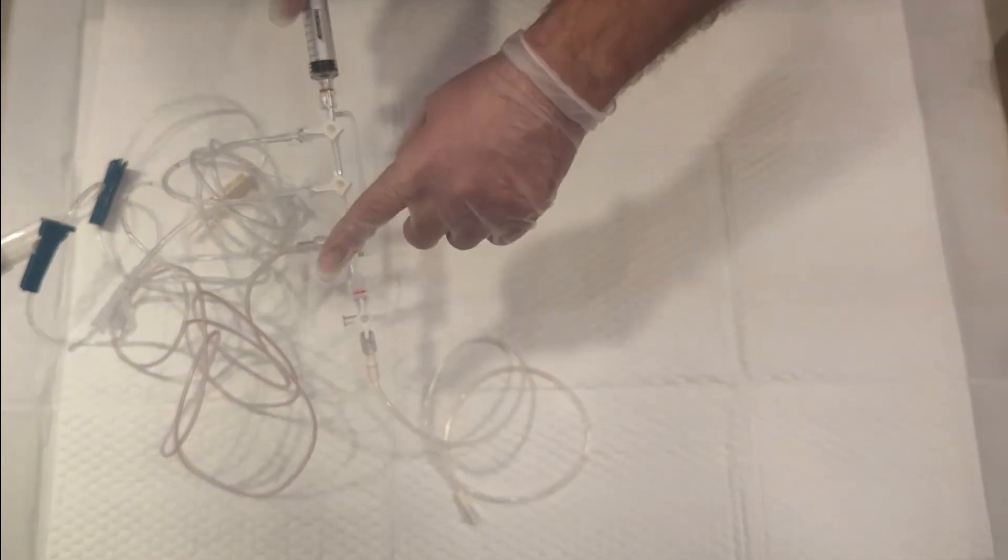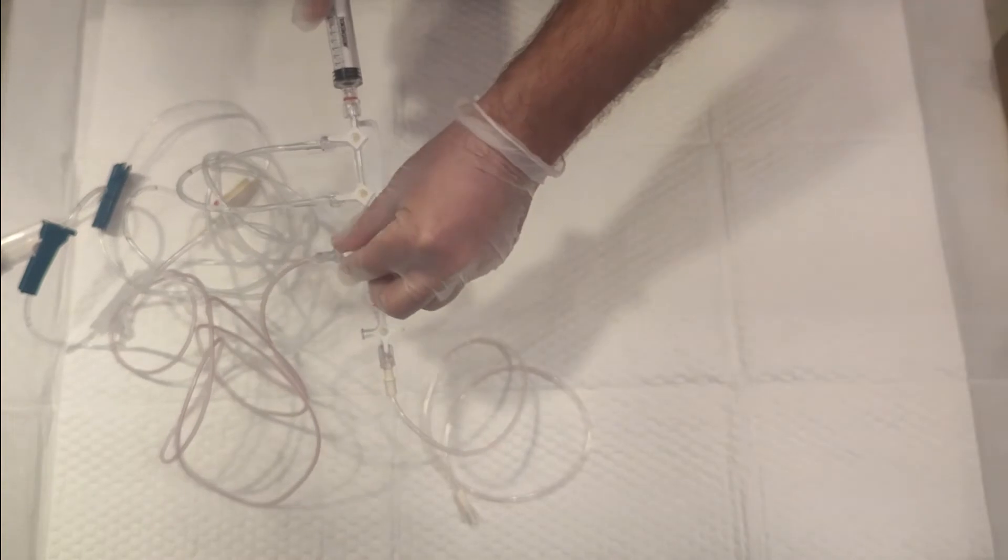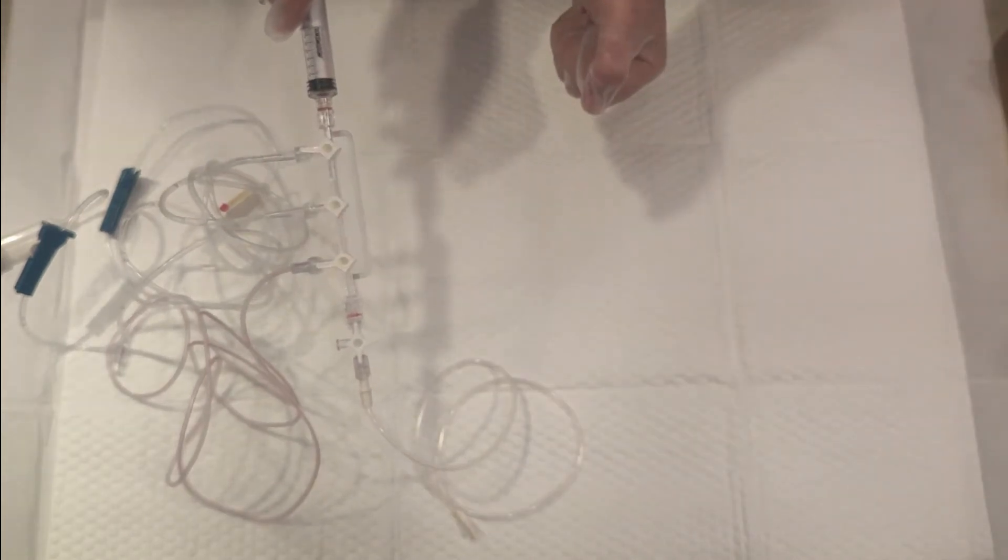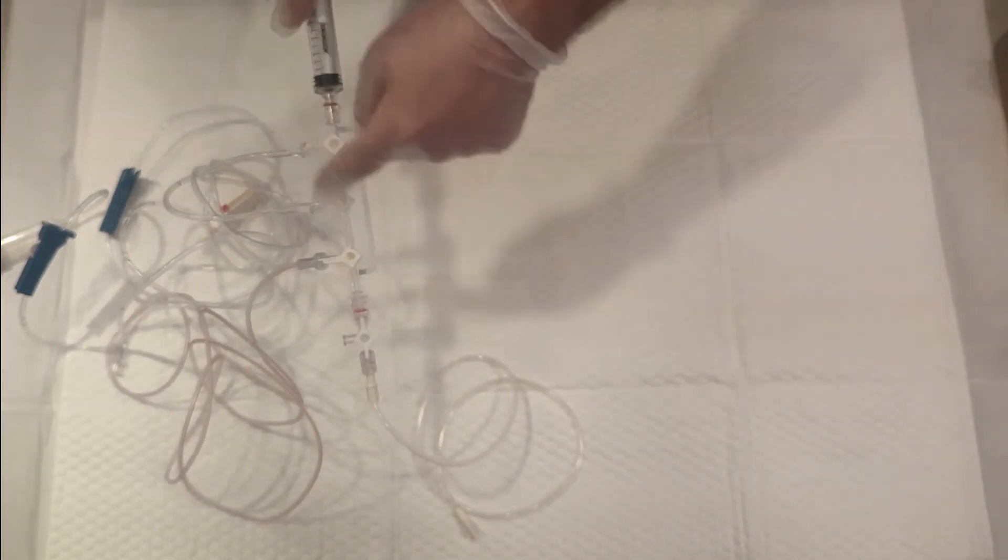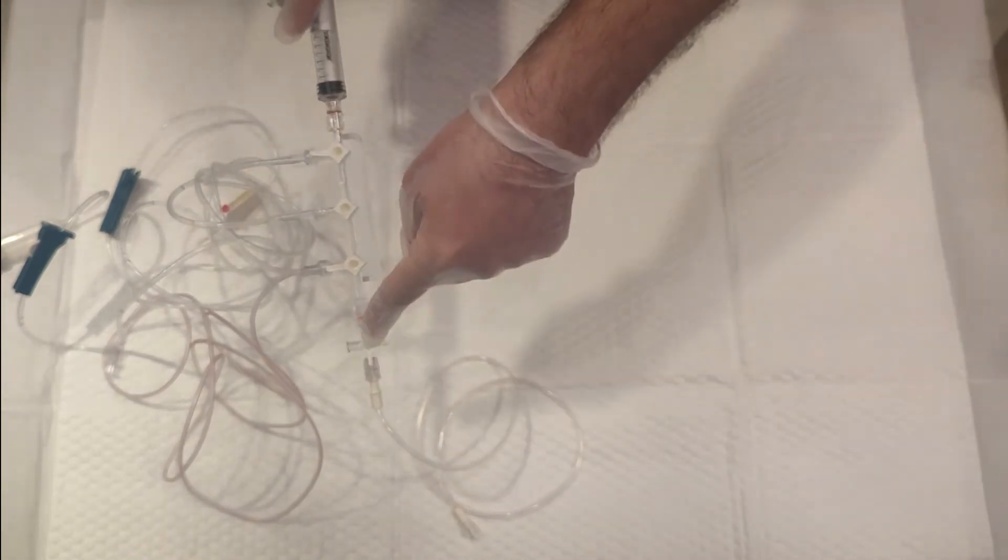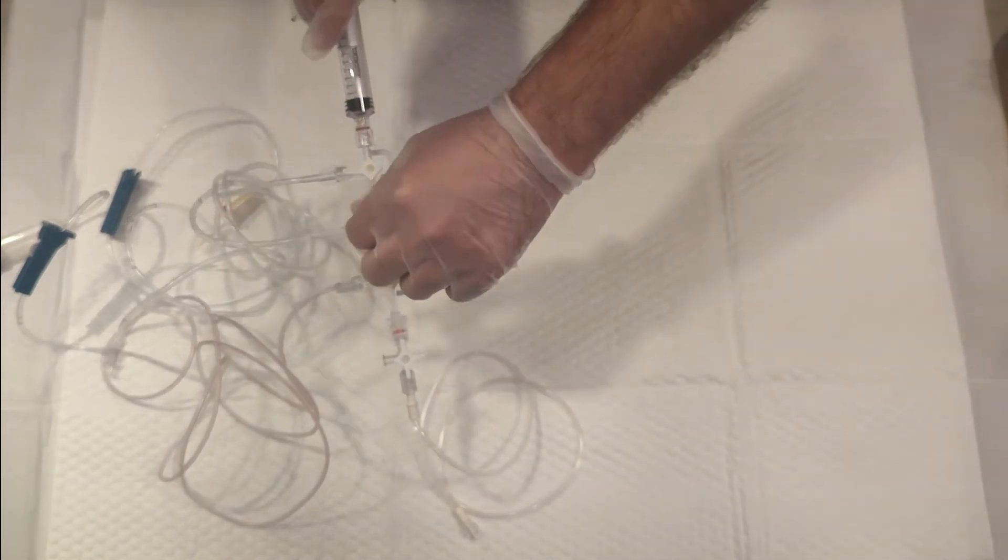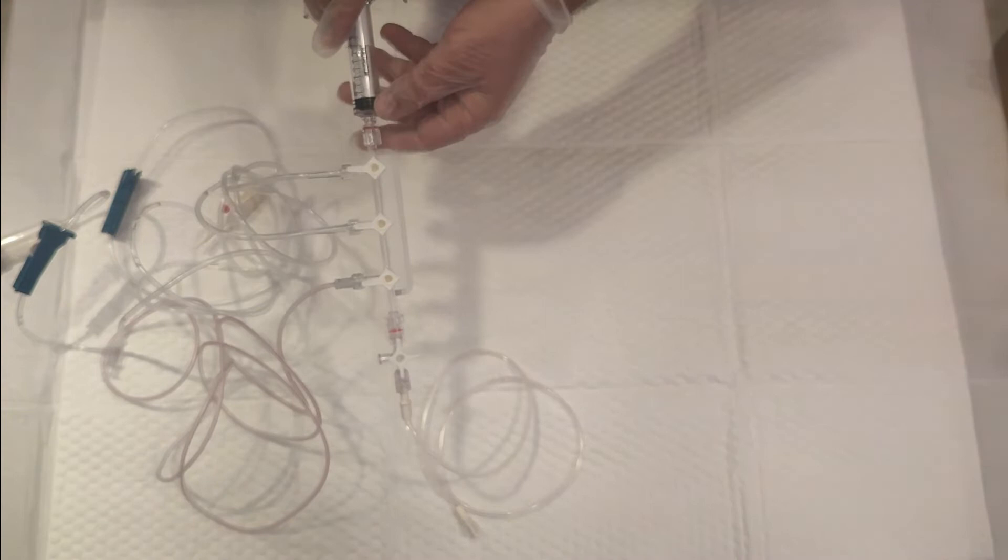For the second one, if it's already a pressurized saline bag, turn it off towards you and on towards the pressure bag and patient side. You'll see pressurized saline coming out. Once it flushes from this line to remove the air, close it towards that side. The third one is the contrast, which is the other way around.